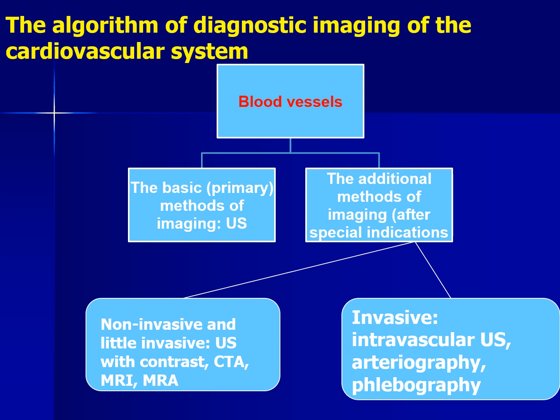Imaging of blood vessels is also divided into basic and additional. The basic method of imaging of the vessels is ultrasound examination, and the additional methods of imaging after special indications may be invasive and non-invasive.